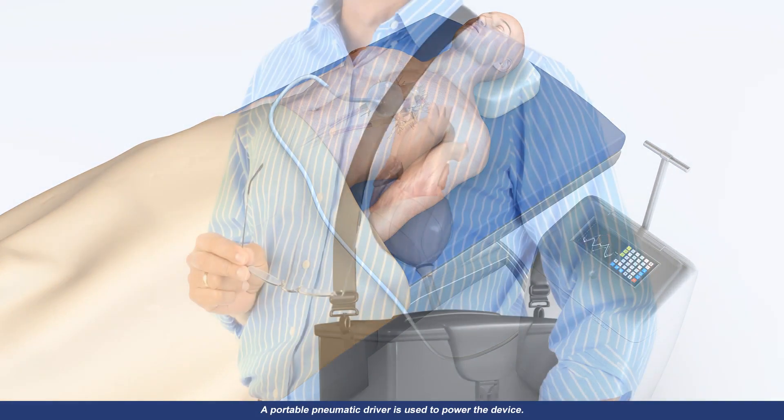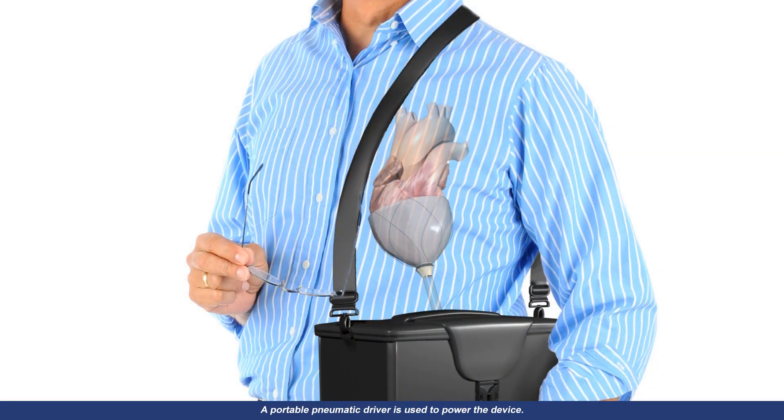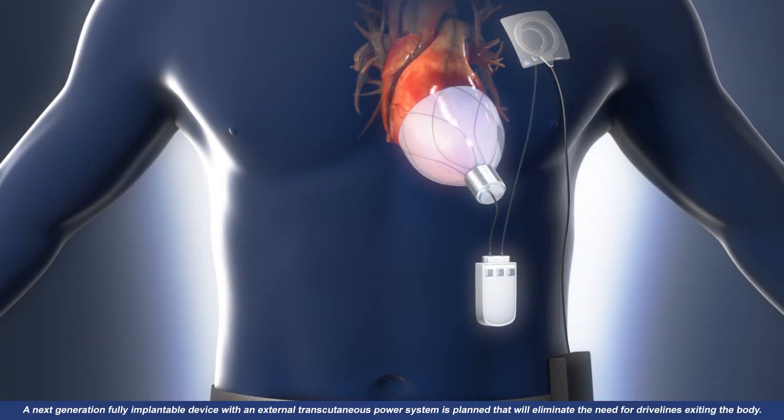A portable pneumatic driver is used to power the device. The driver detects the heart's EKG signal using the soft robot's internal sensors, which enable monitoring of heart performance. The same driver will enable ambulatory use for short-term or bridge-to-transplant patients.